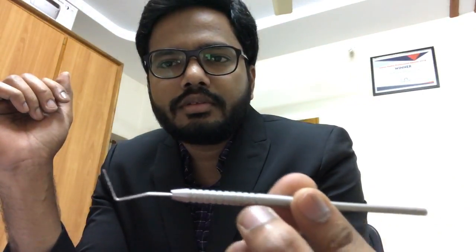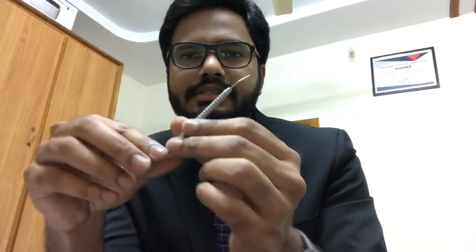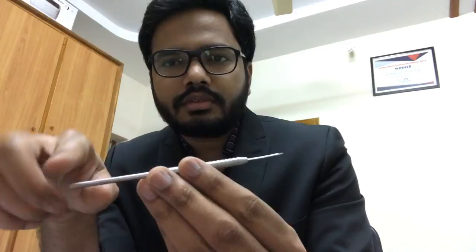As you all know, if you take one hand instrument, for example, as in this case, we have this entire body. So this forms the handle, this forms the shank, and this forms the blade or working portion, right? The area between the working portion and the handle is called the shank. That is the connecting part.